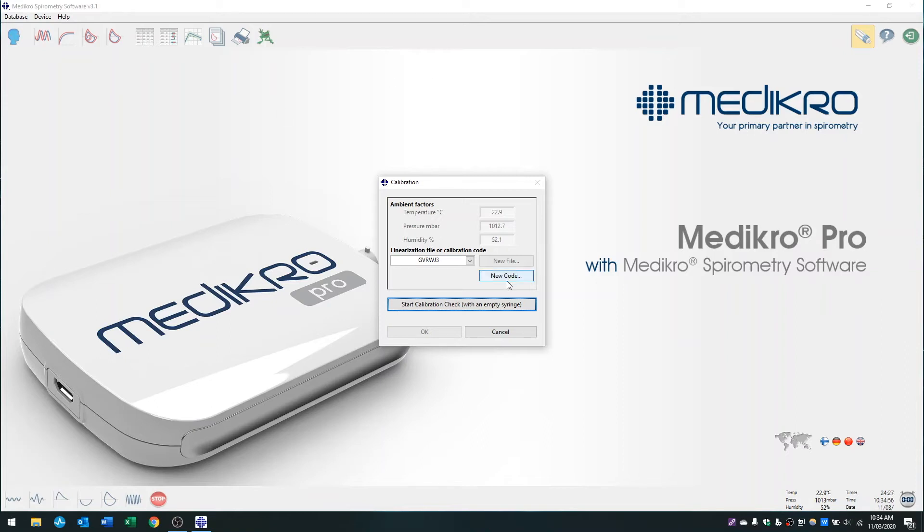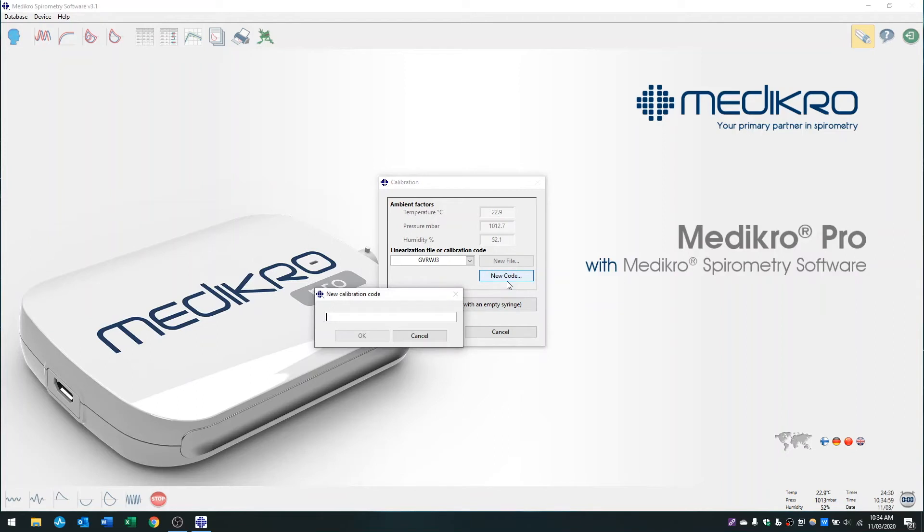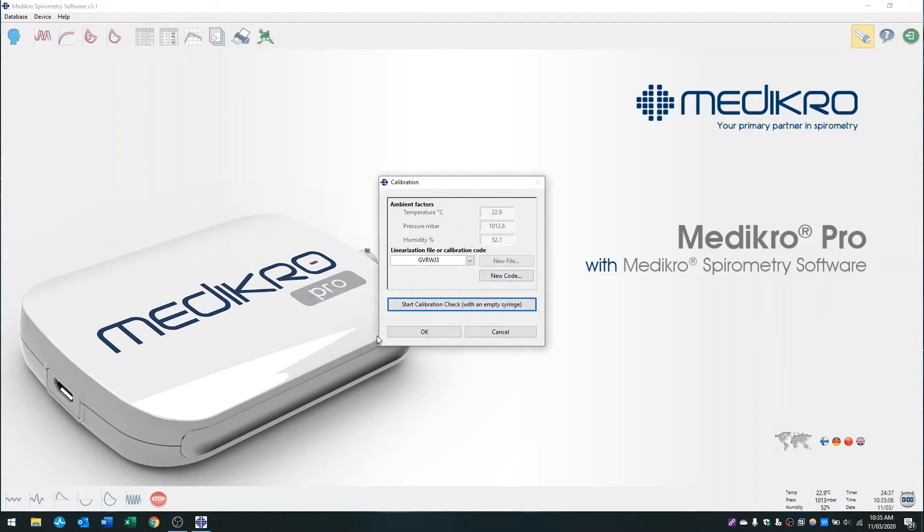In order to enter it, just press new code and I'll enter my new code today. Press okay, and you're ready to perform the calibration check.